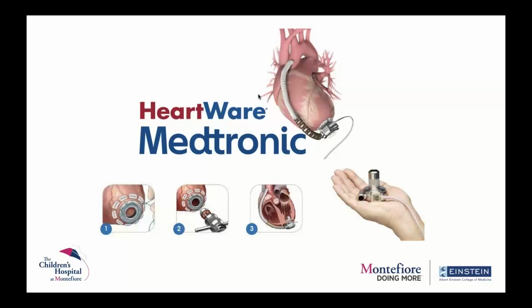The next device I wanted to show you and talk to you about is called the HeartWare or the HVAD. Now, these are implantable devices. So as you can see, compared to the Berlin, where you have the cannulas that sit inside the heart, this is actually a full device that sits or snugs the heart. So you carve out the apex of the heart or the tip of the heart, you take out the core, and you implant this inflow cannula into the ventricular chamber or the cavity. And the pump itself sits inside the body. So it is in the pericardial space or the sac that covers the heart.